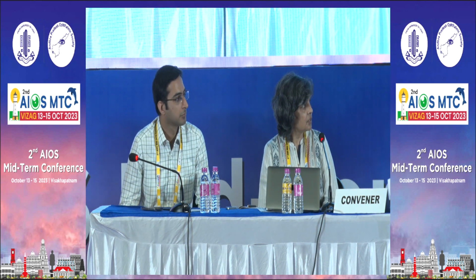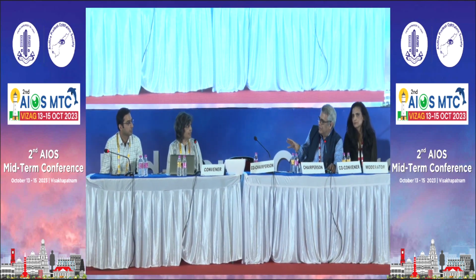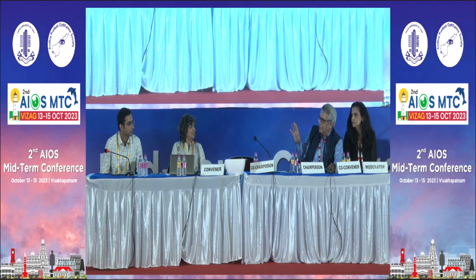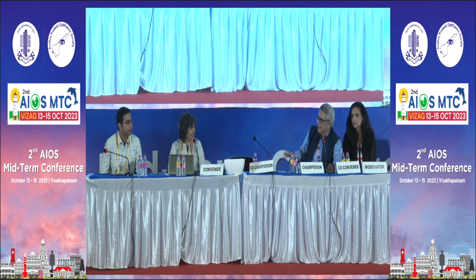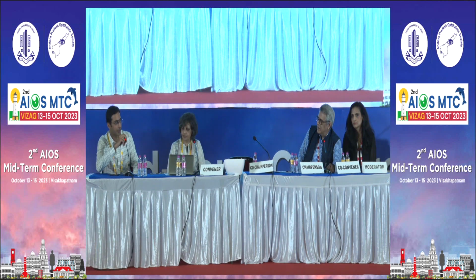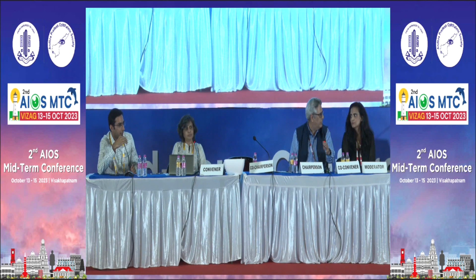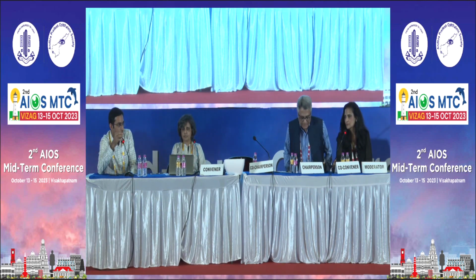I will not, because to pick up a subtle NVE, you have to do a laborious job. NVD is okay. Because 4 or 5 minutes of angiography will reveal more wealth of information regarding this. Only NVD I was saying. I totally agree, because FFA still is an investigation which is usually backstage. But I think FFA really is important, and the role of FFA would be highlighted in the next talk also.